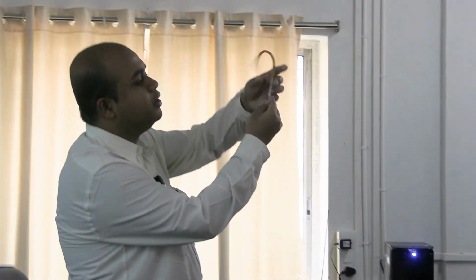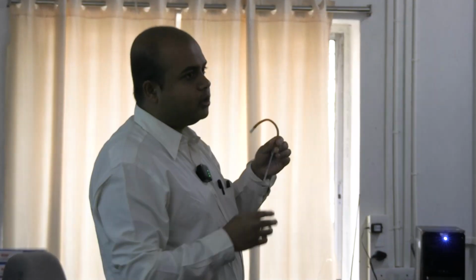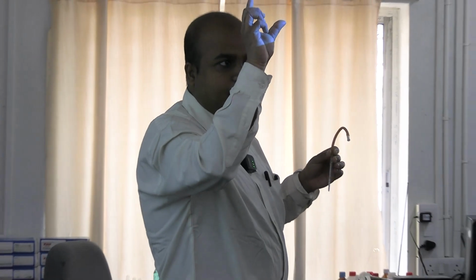This is the WBC pipette. Blood is taken up to this 0.5. Again this has to be explained: 0.5 has no units of volume. This is what was done in the first session on this topic. 0.5 is not milliliter or microliter. In the hemoglobin pipette you took blood up to 20 microliter. If some pipettes only hold 10 microliter, you have to take it twice. But here it is not about microliter, it is just parts of volume. This 0.5 can be say 4 microliter, 5 microliter. If 0.5 is, I am just assuming one figure, 4 microliter, then this 1 means 8 microliter, double of that.